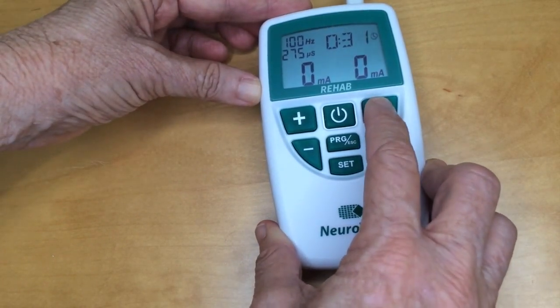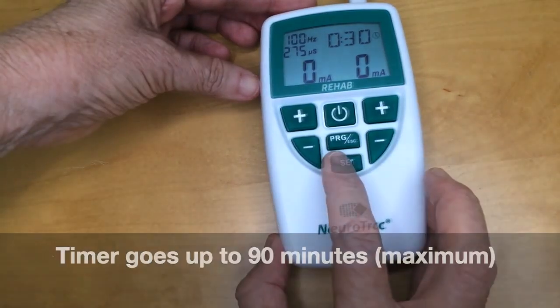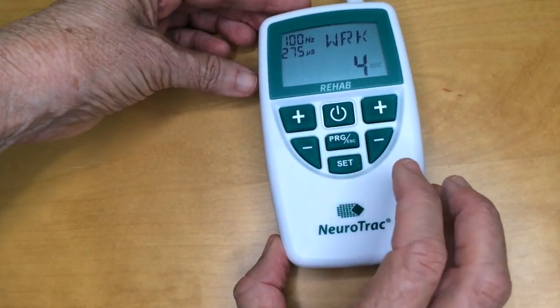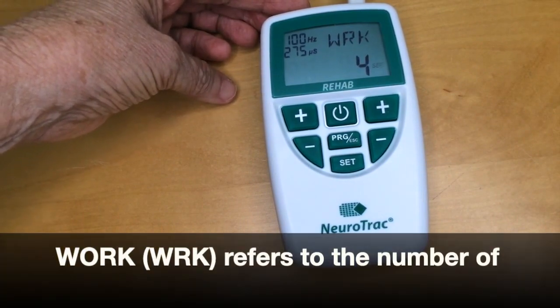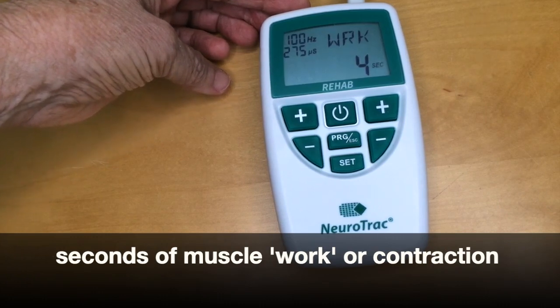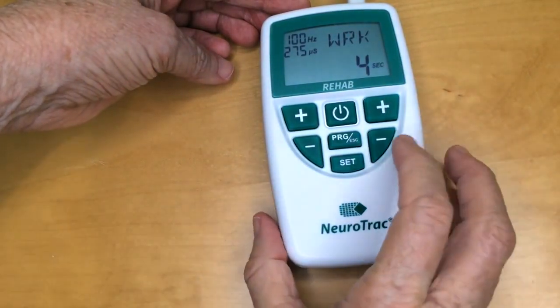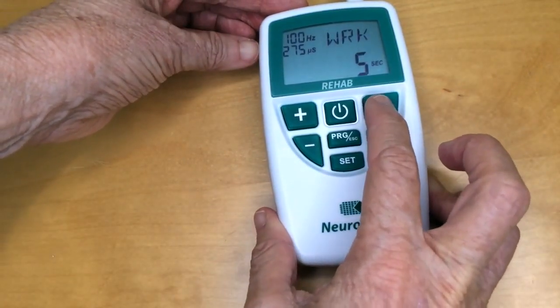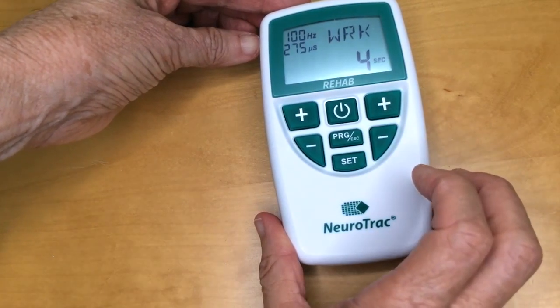Press set again and here's the work symbol flashing. Work refers to the number of seconds of muscle work, contraction, or activation — for example, 4 seconds, 5 seconds, 6 seconds. The work period can be set from 1 to 99 seconds.